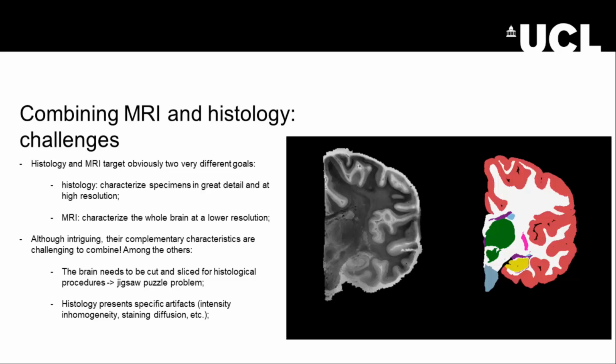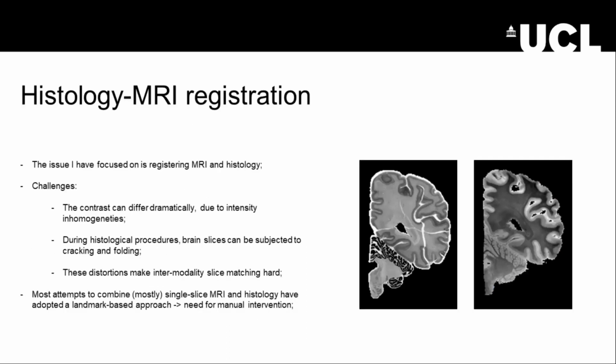If we help ourselves using both MRI and histology, maybe we have some chances, hopefully. But of course we need to take into account the fact that they are very different modalities, they have a completely different contrast, and histology has its own kind of beasts, which are the histology-related artifacts.